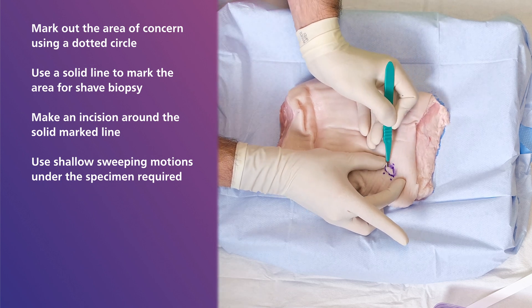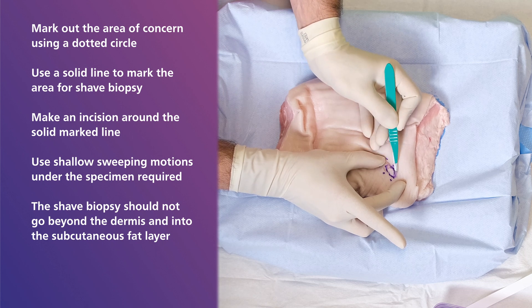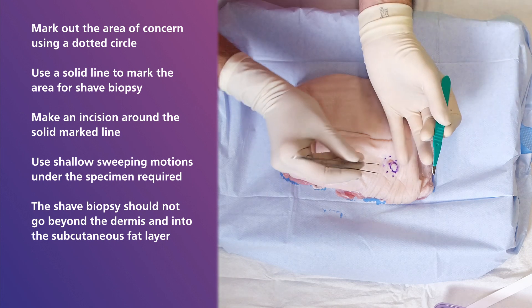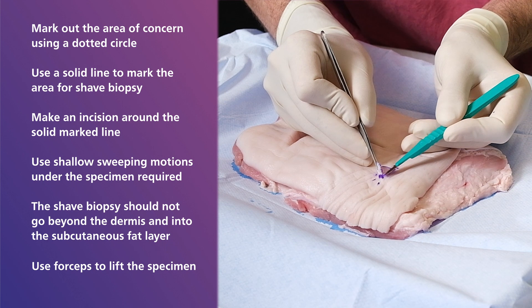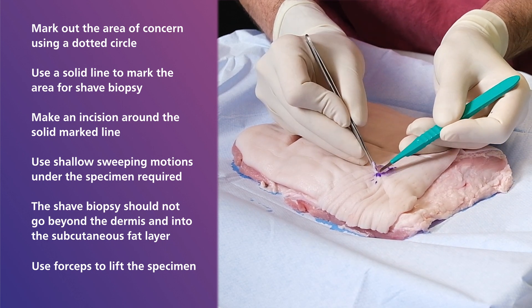In most cases the shave biopsy should not go beyond the dermis and into the subcutaneous fat layer. To deliver the specimen, it can be helpful to use forceps to lift the specimen, allowing for visualisation as well as to provide traction.